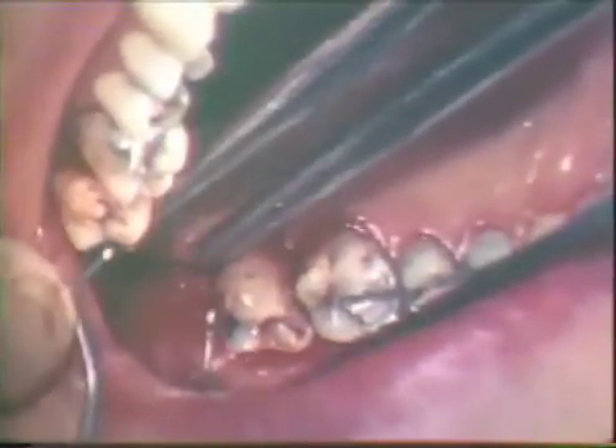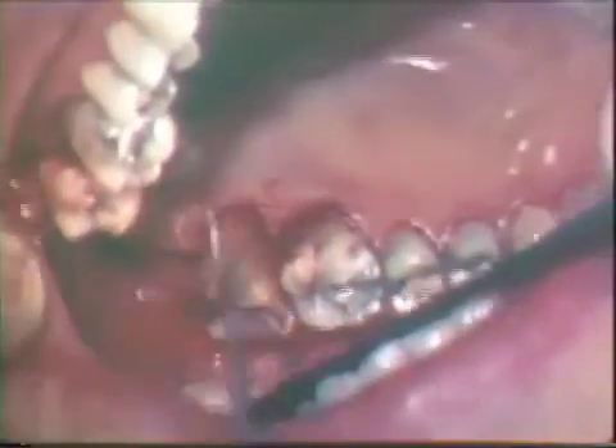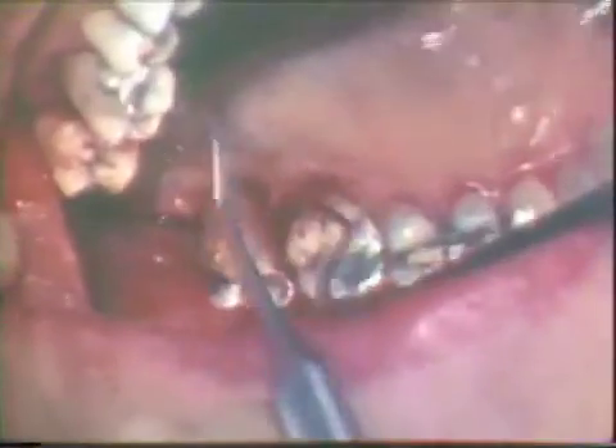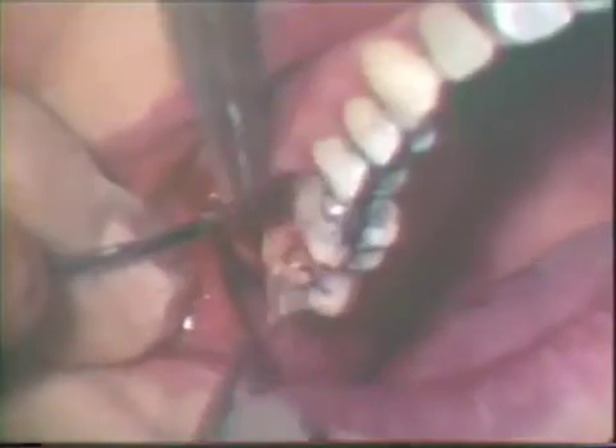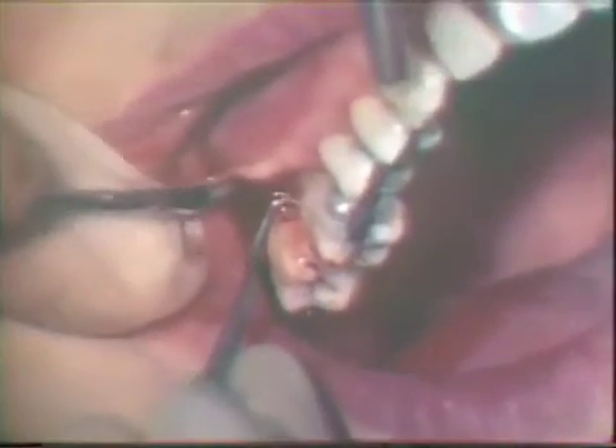The connective tissue that was separated from the flap and the bone is removed with a curette. The roots are thoroughly planed with curettes, starting at the distal aspect of the second molar. It is important that this planing include all the surfaces of the teeth that were previously exposed in the periodontal pockets. The buccal flap is deflected and the interproximal soft tissues are removed. The roots are also thoroughly planed. There is no trifurcation involvement on any of the teeth.